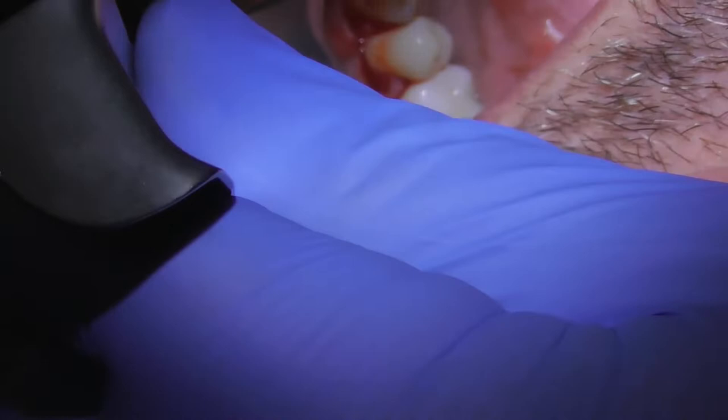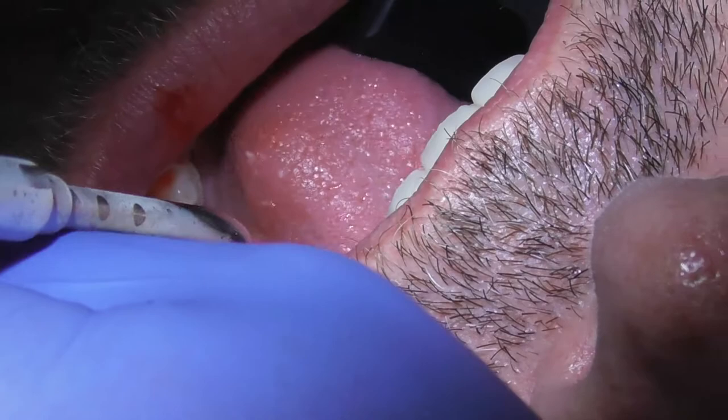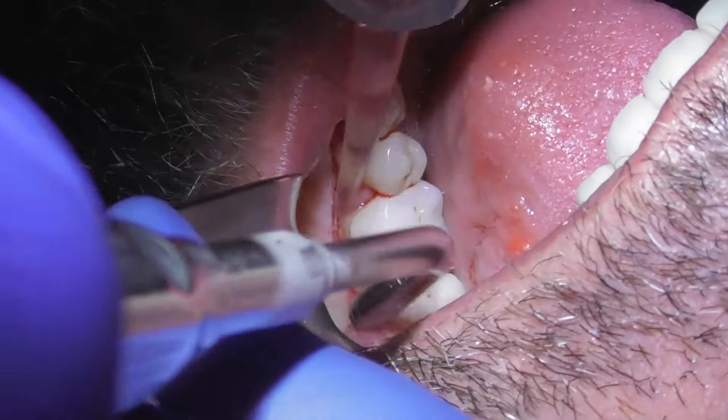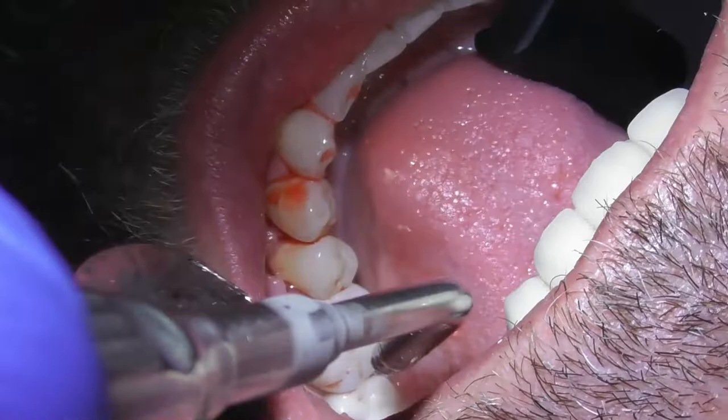Now I always like to palpate and run a finger over there to make sure things are smooth. I'm going to flip this tissue back where it needs to be and just settle it down. We're basically done with all the smoothing. Now I'm going to give it a big rinse — lots of sterile salt water — to flush and make sure things are super clean in there. Then we're going to put some dissolvable stitches in.